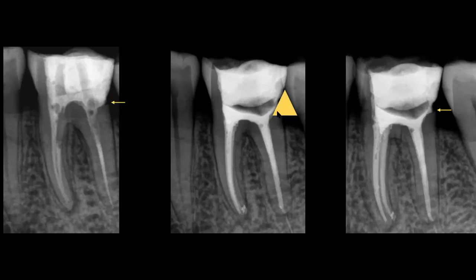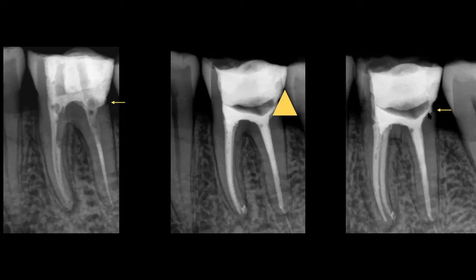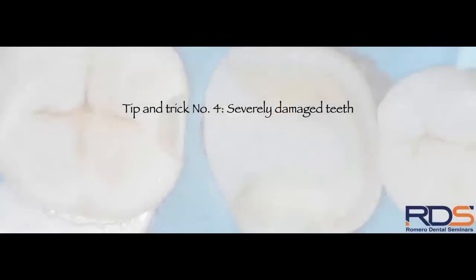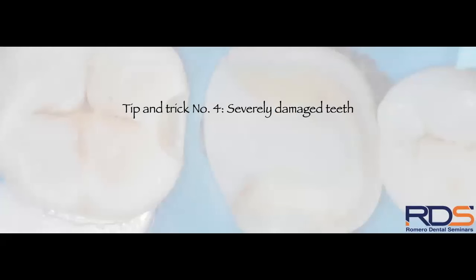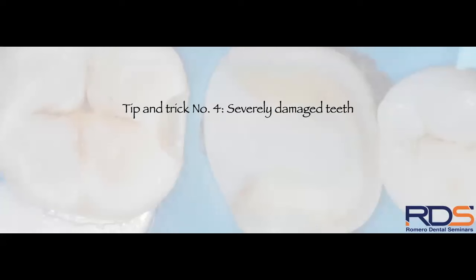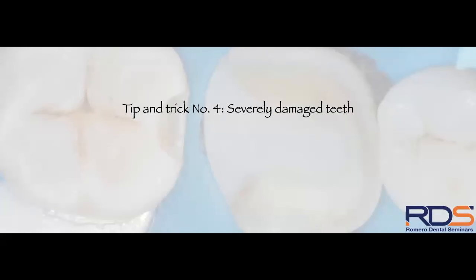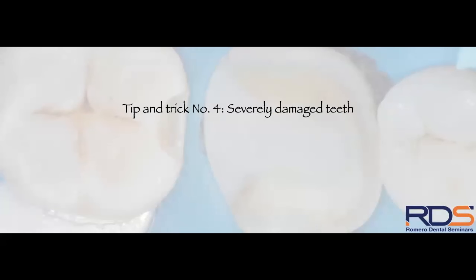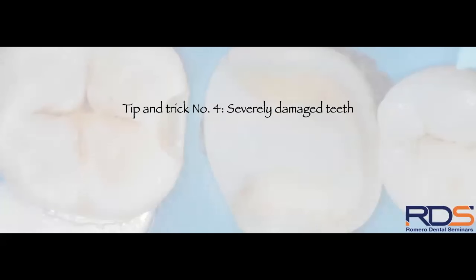That is the number one reason to section the band and avoid wedges during margin elevation — you prevent the band from being pushed into the preparation. Margin elevation should not re-establish a contact, so no wedge is needed at that stage. Once the margin elevation material is light-cured, you now have something solid to wedge against — the polymerized resin composite or RMGI — and you can place a new band and wedge normally to recreate the proximal contact.